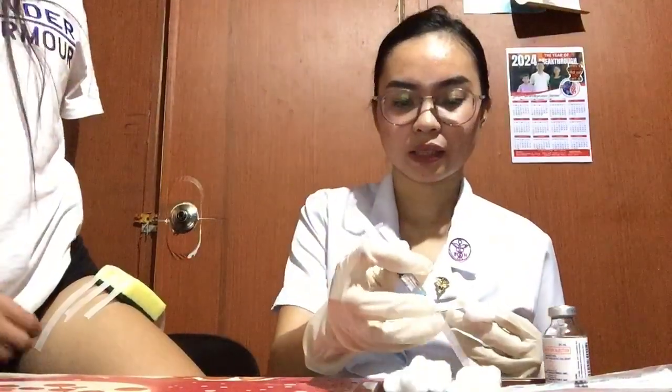Use the ulnar side of the non-dominant hand to pull the skin approximately 2 to 5 centimeters to the side. Hold the syringe between the thumb and forefinger as if holding a pen, and then pierce the skin quickly and smoothly at a 90 degree angle. Hold the barrel of the syringe steady with your non-dominant hand, and aspirate by pulling back on the plunger with your dominant hand. Aspirate for 5 to 10 seconds.